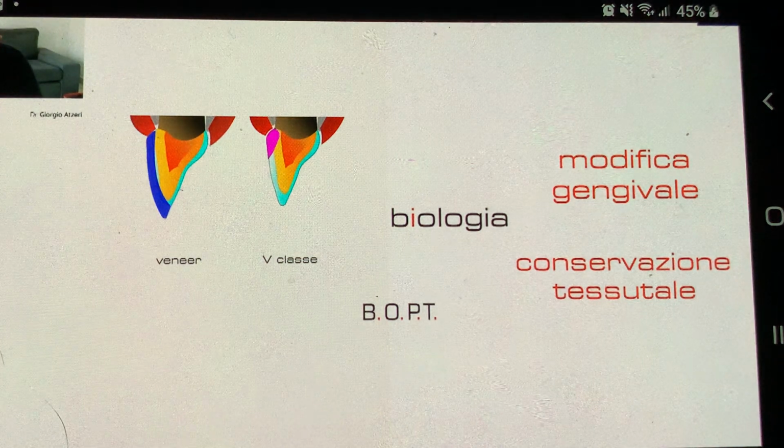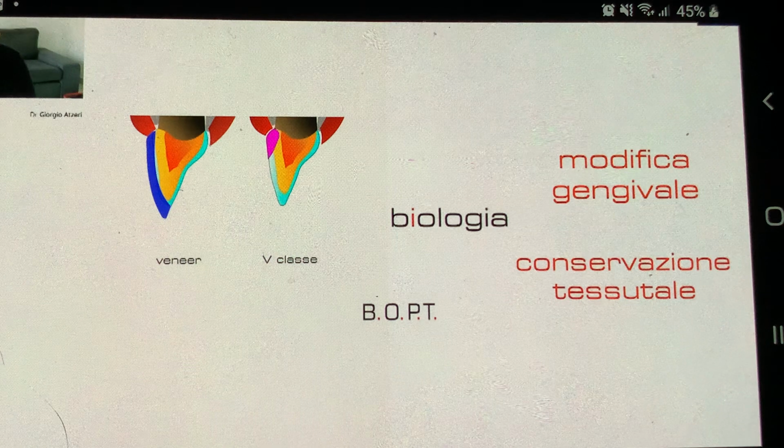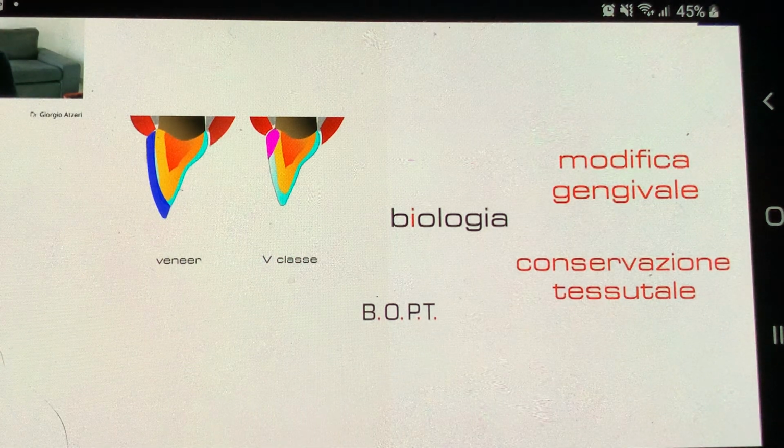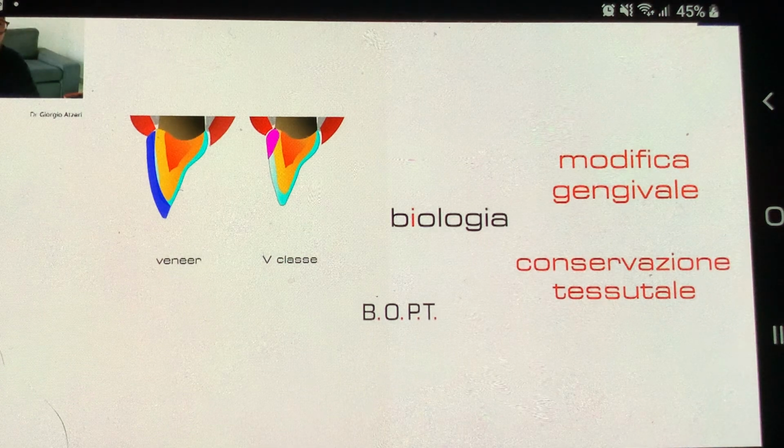This is true for prosthetic teeth and implants, where we have a lot of space, because with the burr we create a space for the provisional tooth, and with the implant there is a lack of tooth, there is only gums, so we have lots of space where the shape can be used to move the gums.